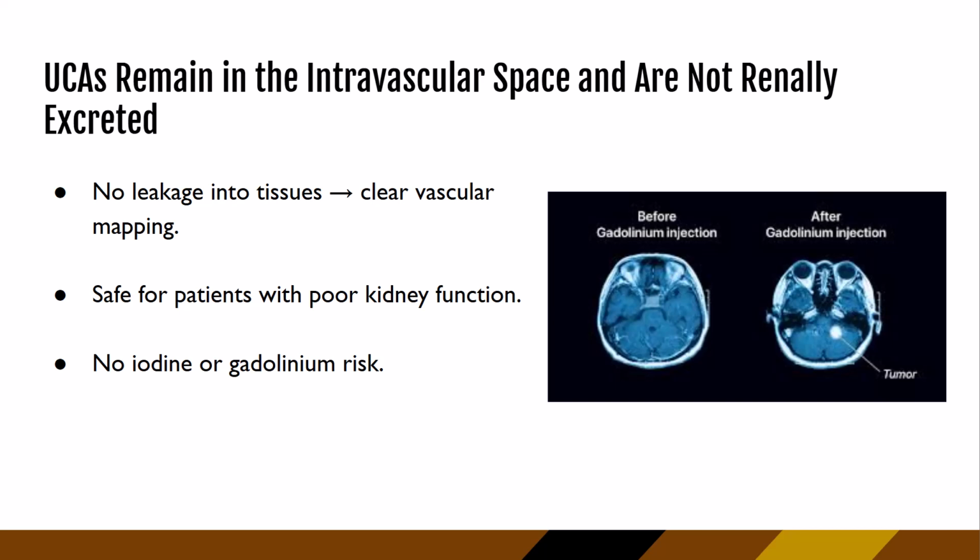So in this example here, this is an MRI, and we can see this is the before gadolinium injection, and it's the same idea as MRI and CT contrast. We inject it into the blood, and then it's supposed to show up as brighter or enhanced on whatever modality it is using. The big difference, though, is that gadolinium and CT contrast are supposed to also leak into the tissue itself. So in this example, it really highlights the whole tumor.